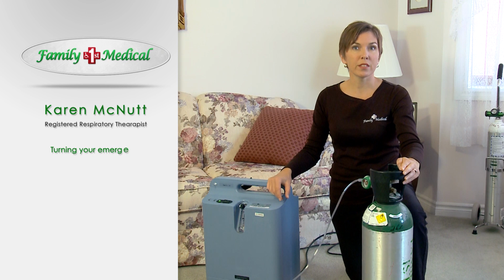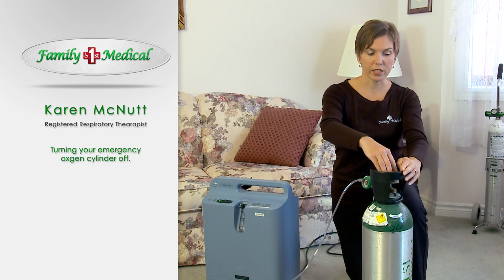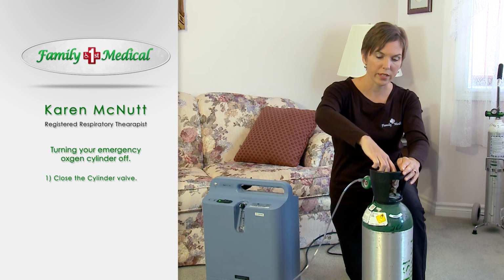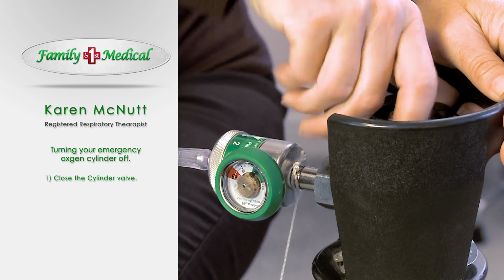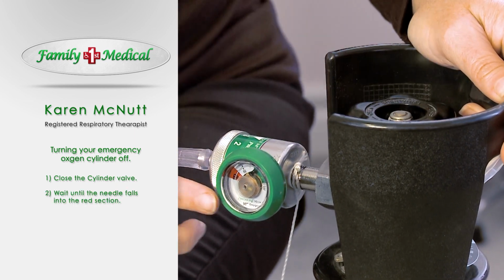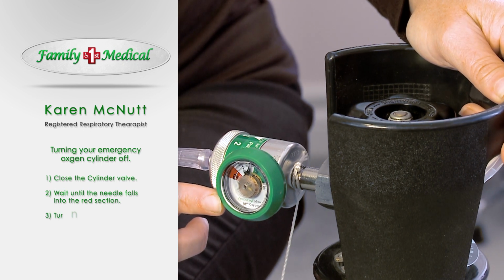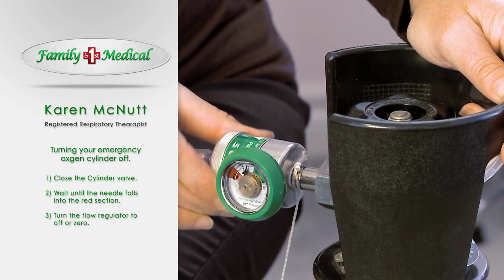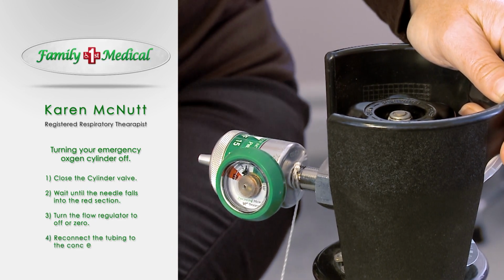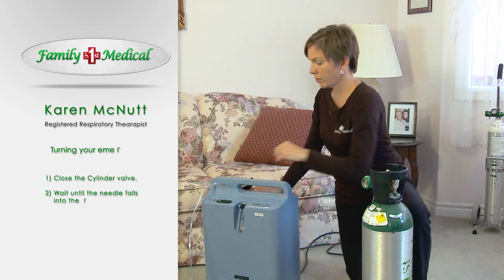We're going to do steps in the same order that we did when we turned the unit on. Start with the cylinder and close the cylinder valve. So we're going to turn it clockwise until it's tight. You then want to watch the needle until it falls to the red section. Once it's hit the red section, we're then going to turn the flow back to off or 0. You can disconnect your tubing and reconnect to your oxygen concentrator.